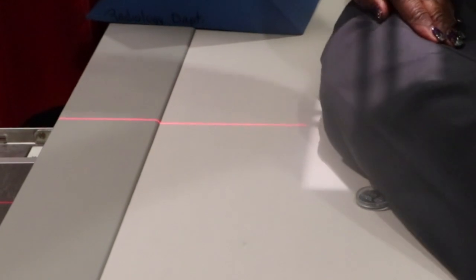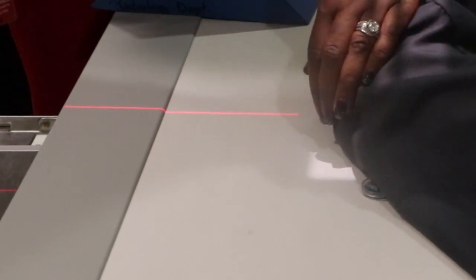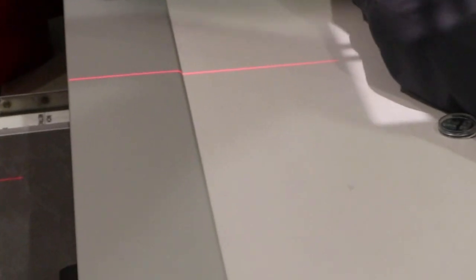And my central ray is going to be about a half inch distal to the medial epicondyle. Okay? And we can feel the medial epicondyle here. It's the rounded projection here. Here's the apex of the patella. So your joint space is right there, so that's where we will be centering.